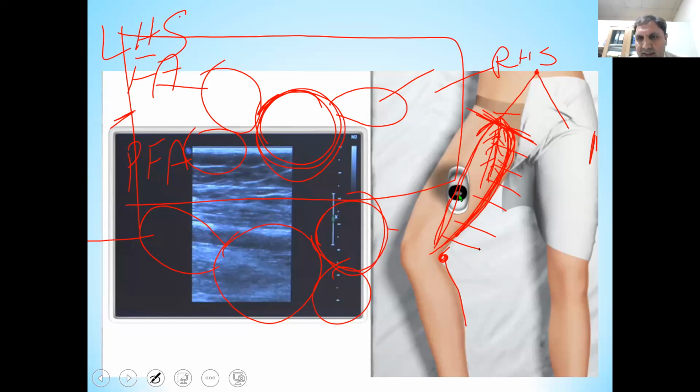also termed as leg pattern, leg fashion. And so you have to move your transducer up and down over the great saphenous vein to look for its internal branches or external branches, any perforators.